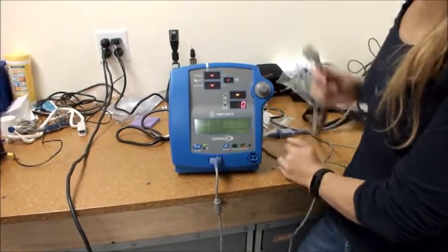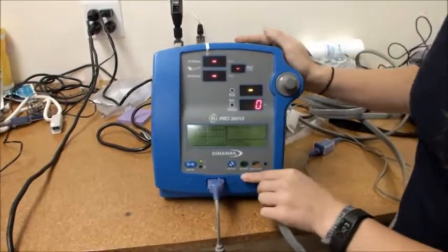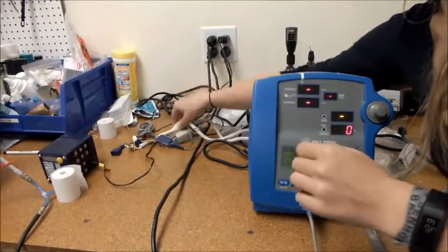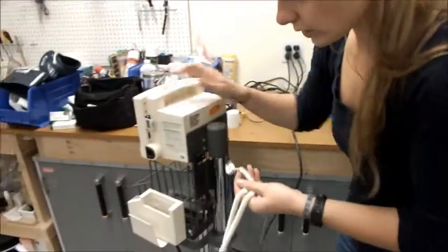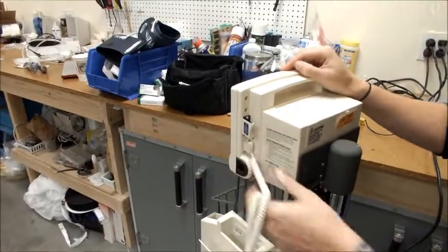The next step would be to click in the blood pressure tubing. And on machines with temperature, you're going to want to take the temperature probe that you found and connect it where it says or indicates the temperature connection, like that.